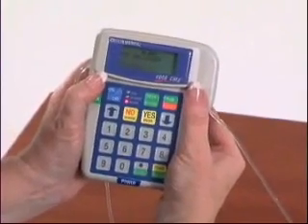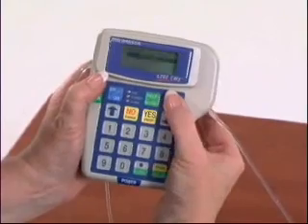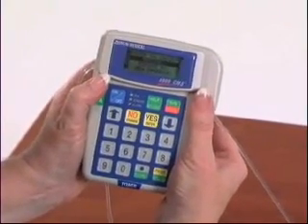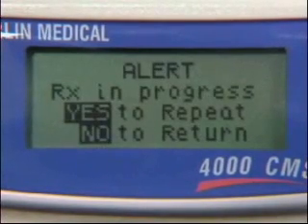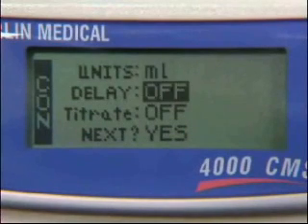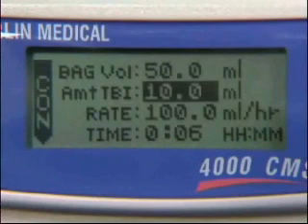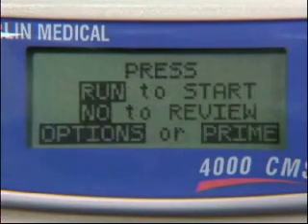Upstream occlusion alarms usually occur when the bag has run dry. To silence this alarm, press the Pause button and check the bag. If you need a new bag, replace the bag. Use the down arrow to highlight the Repeat RX line and press Yes Enter. Hit Yes again. The pump will slowly scroll through the program so it can be reviewed. Hit Yes again, then press Run to start the infusion again.